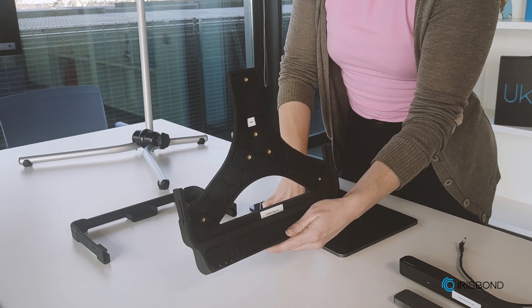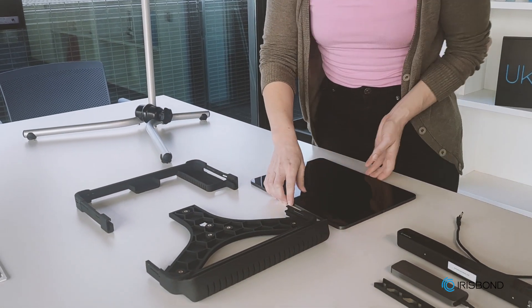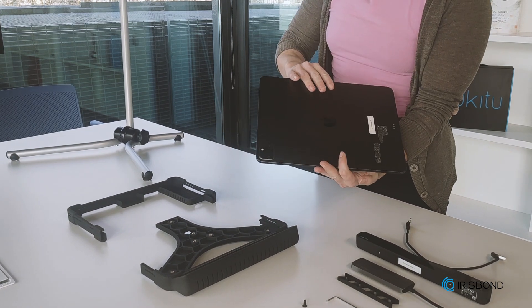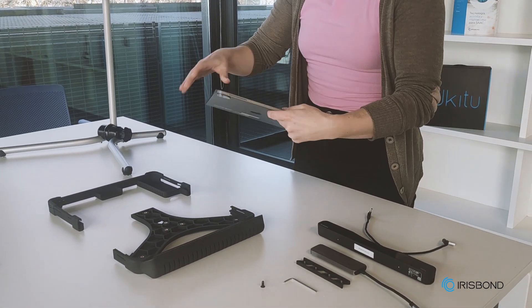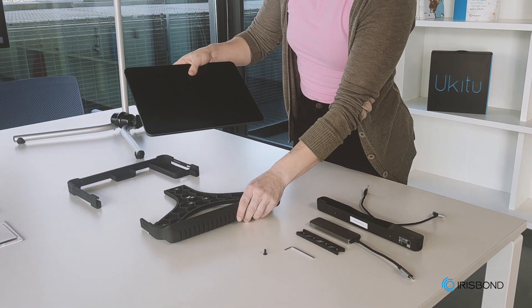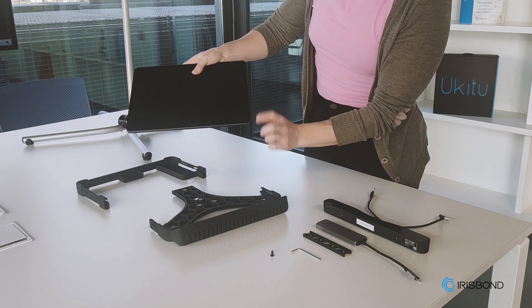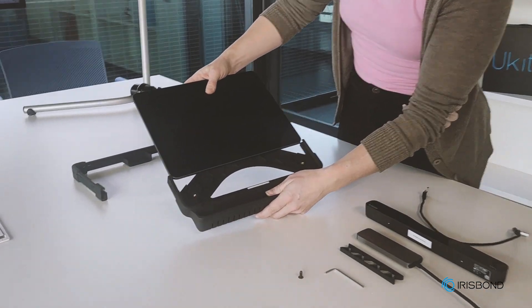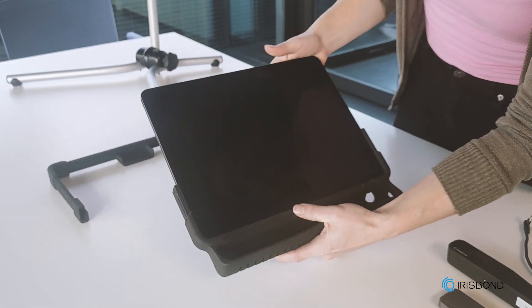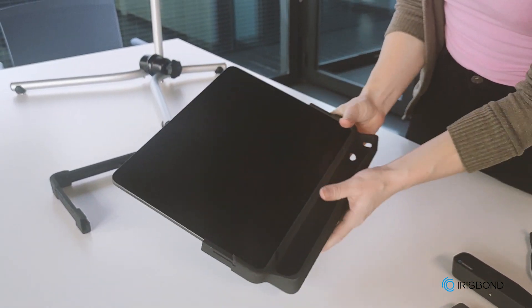I'm going to take my iPad — this is an iPad Pro 12.9 inch — and I'm going to put it into the bottom part of the Osco with the charging port on the right side. It just slides in. Perfect.